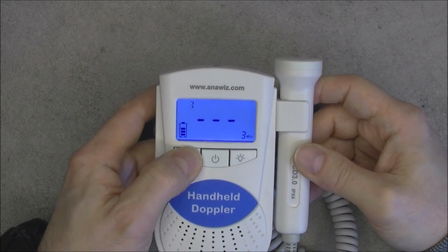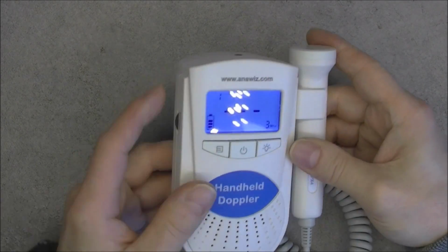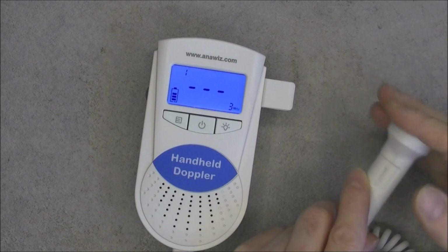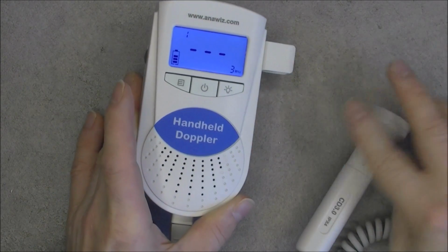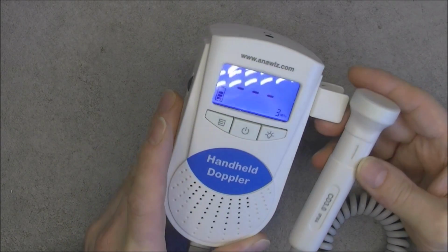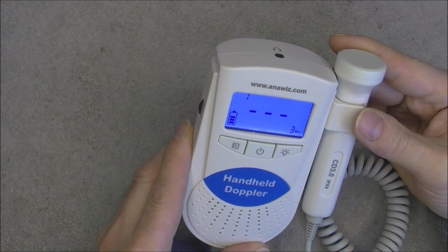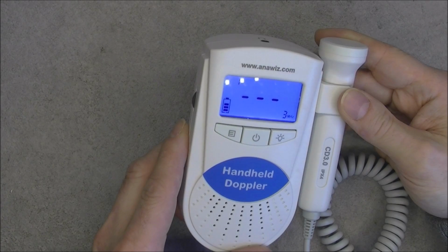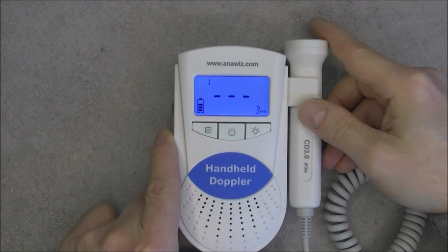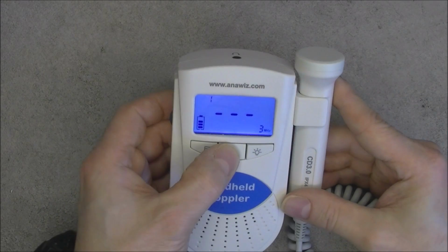You can have real-time or average measuring modes, and it does nothing else except amplify the noise a little bit. I did try it on myself and it really does not detect any heartbeat, so probably the probe is defective. You can just hear a little bit of background noise in the speaker and nothing else. So it is a perfect teardown item.